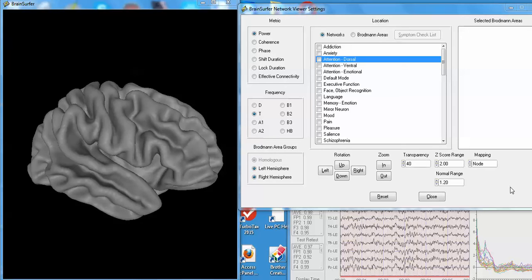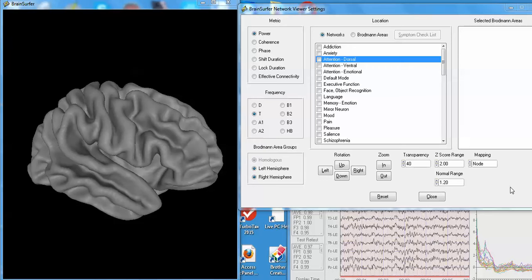This is a video of the BrainSurfer Network Viewer. It's a new add-on to NeuroGuide. One activates this particular tool for the purposes of assessment of different brain regions and different brain networks of patients that may be having various symptoms.